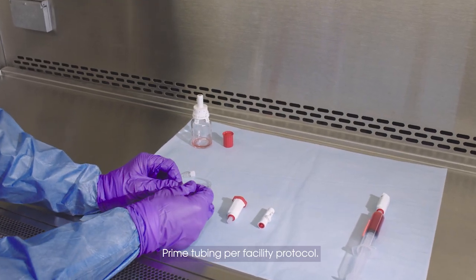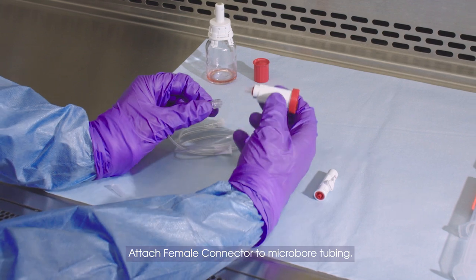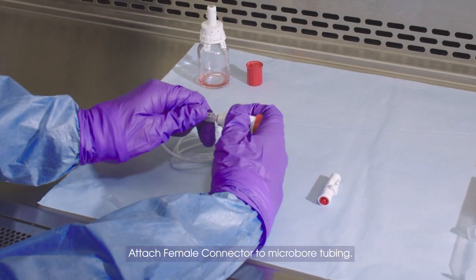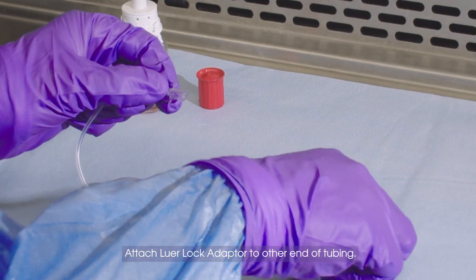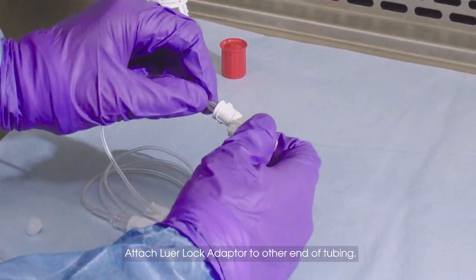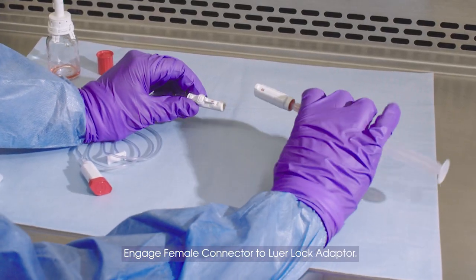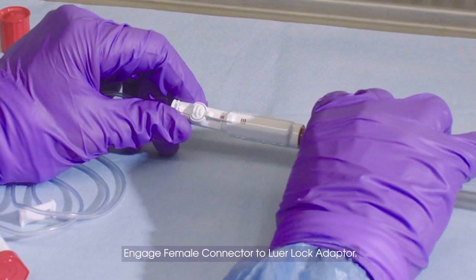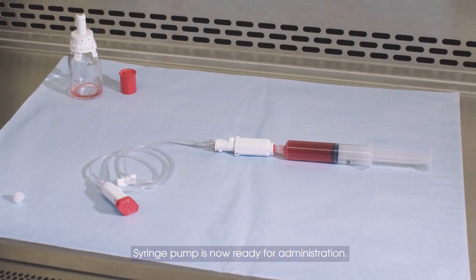Prime tubing per facility protocol. Attach female connector to micro-bore tubing. Attach lure lock adapter to other end of tubing. Engage female connector to lure lock adapter. Syringe pump is now ready for administration.